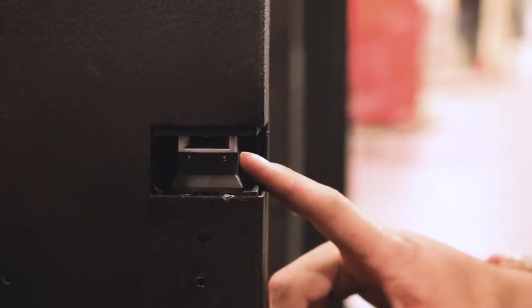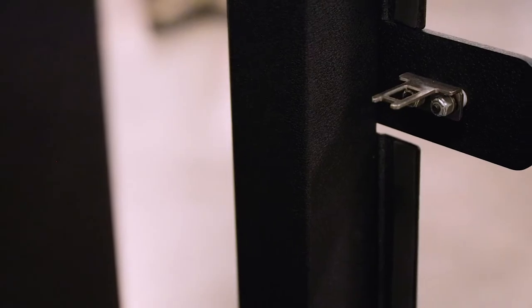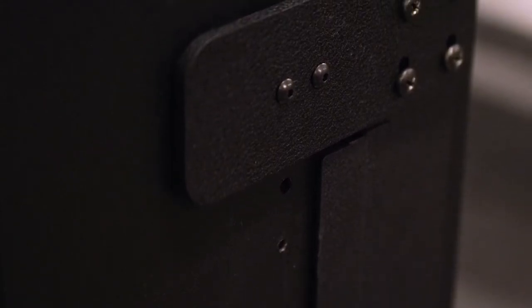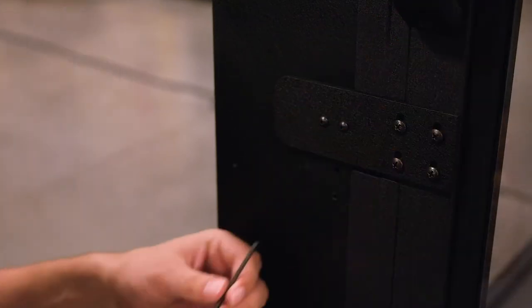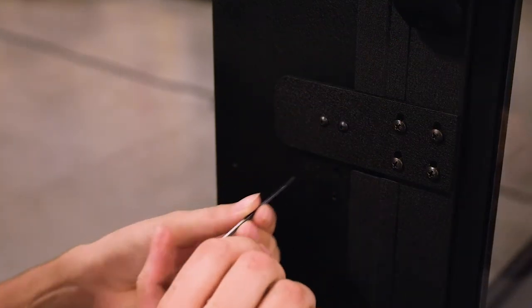For this type of interlock, the silver actuator must be fully inserted into the interlock mounted behind the cutout for the lift to think the gate is closed. The actuator also needs to be inserted for the interlock to be able to lock. This style of interlock can be manually overridden, which prevents the interlock from being able to lock. If the interlock is overridden, insert a 7/64 hex key to engage the triangular recess in the interlock switch and gently turn a quarter turn clockwise.